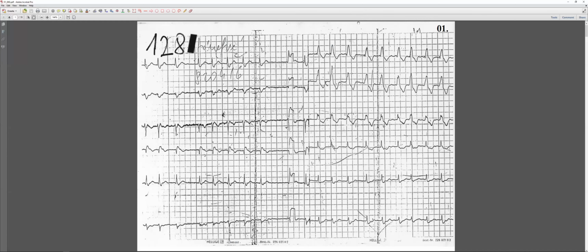Okay, someone, I give you a good ECG. Yes, I need a very good one for you. Oh, okay. Yes, this is for you. Okay, I am sharing my screen. I'm projecting the tracing and giving the ECG. Yes, it's yours. Okay. Big breath. Jesus Christ, you are blowing me out.